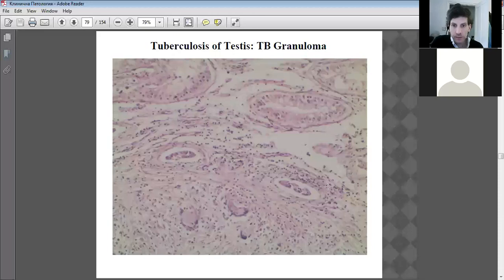There's a lovely magnified slide. You've got the fibrous border around the mass. The macrophages are lovely there, nice detail. Nucleus of the macrophage, nice there. The cells here are becoming disrupted. Why I say that is because there's some droplets forming in the cytoplasm, the round, clear white areas.